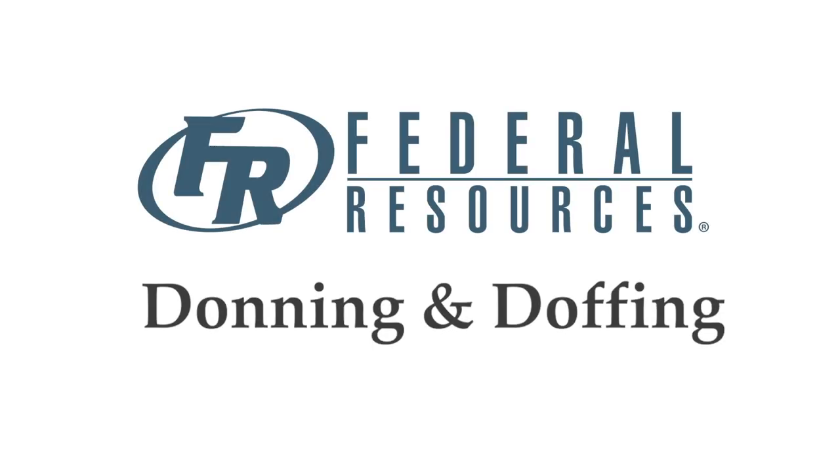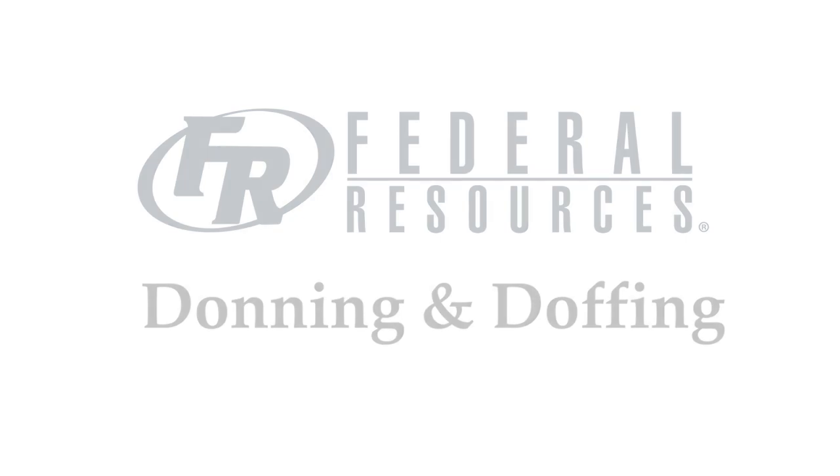The following video shows the proper donning and doffing of the AAMI Level 3 Isolation Gown. This gown has been approved by the Association for the Advancement of Medical Instrumentation, or AAMI.